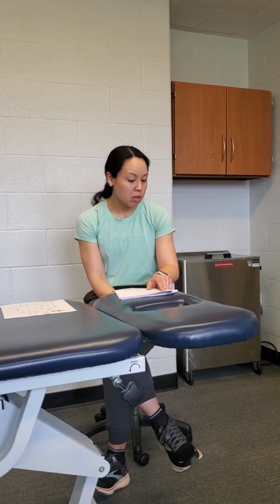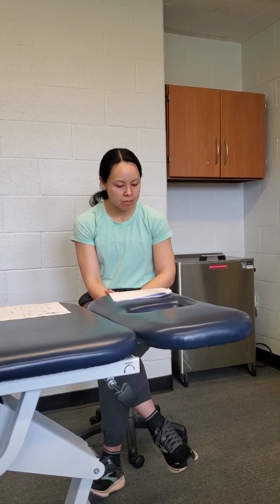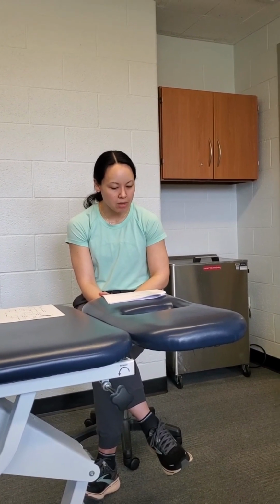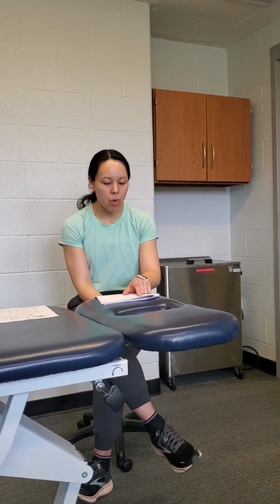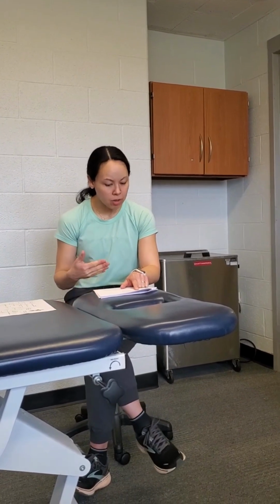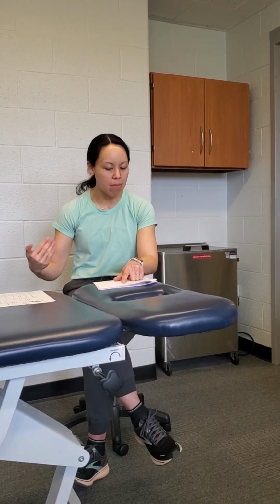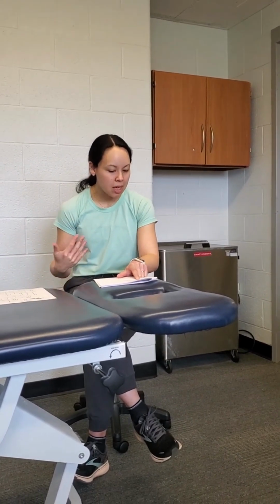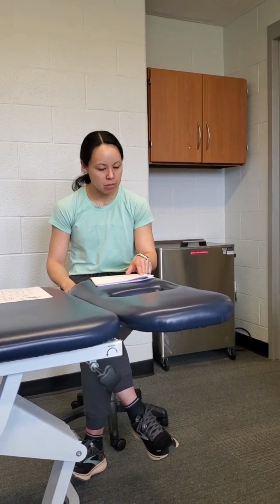They can do intervals on the bike or a steady state. It depends on what they can tolerate and what you're going for. If you're doing intervals, then you would want to do 5-minute intervals, then deflate the cuff and repeat that for about 3 bouts. If you're doing steady state, just leave the cuff inflated the whole time.